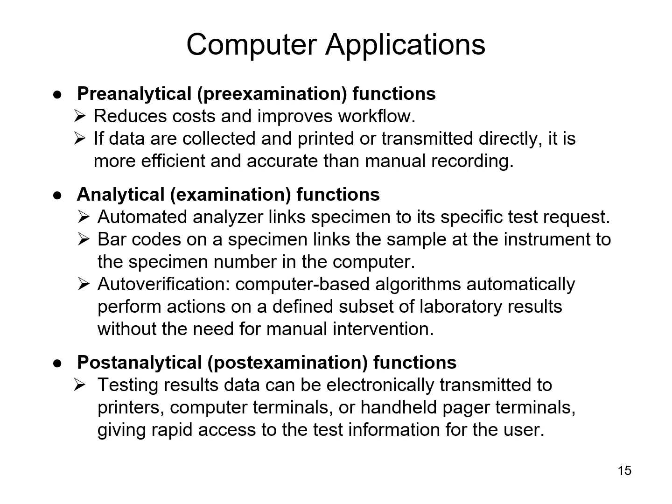Your post-analytical phase is going to be after the examination. So this is actually transmitting those results to the proper place. This could be faxed results, it could be going to the computer, it could be sending out critical results to various pagers and notifying those doctors of those results if there are critical values.